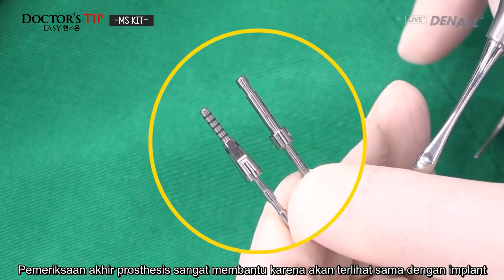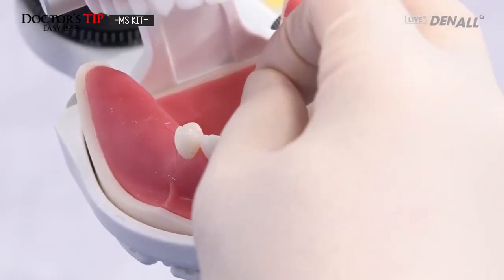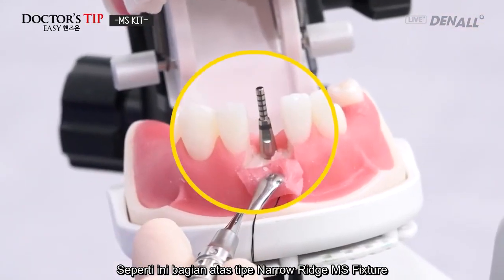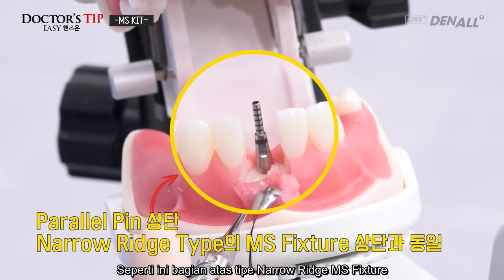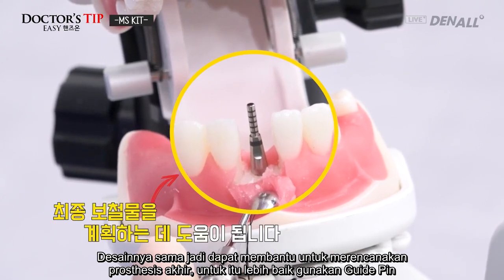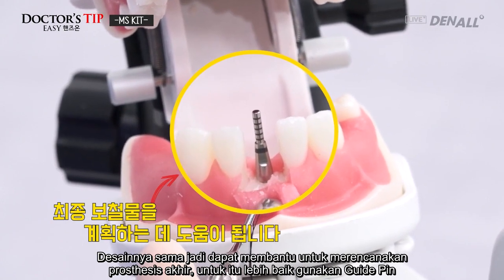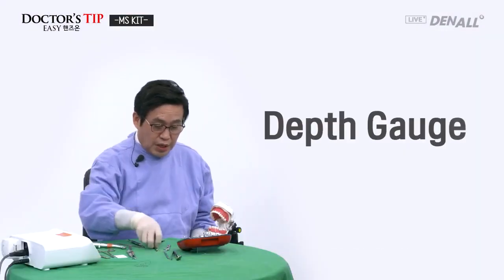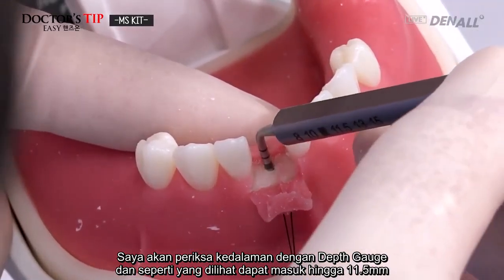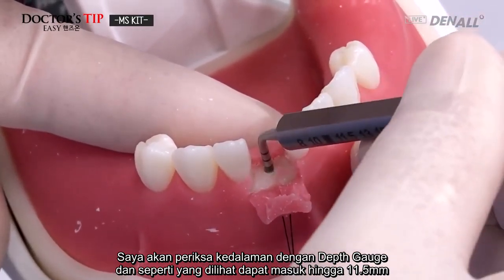Checking the final prosthesis is helpful because it looks the same as the implant. So you push in the guide pin, and like this, the upper part, the narrow ridge type MS fixture. The design is the same as I told you, so it's helpful in planning your final prosthesis. So it's a better guide pin for doing that. Again, I'll check the depth with the depth gauge. And as you can see, it's sufficient, drilled up to 11.5 millimeters.